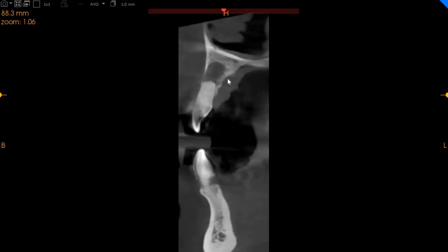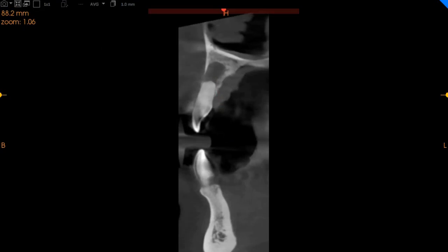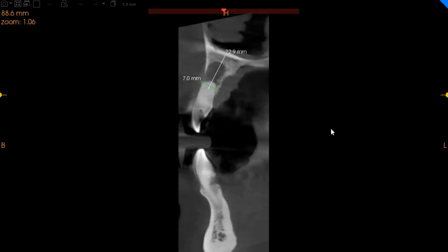This is the upper right lateral incisor. Again, severely resorbed roots with a periapical infection right here. This tooth is also severely compromised. We have 6mm of ridge width with 11mm of height.